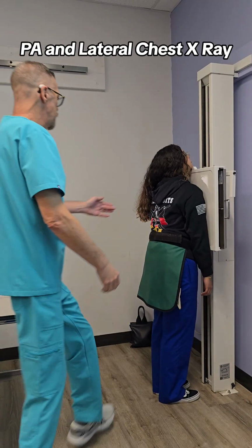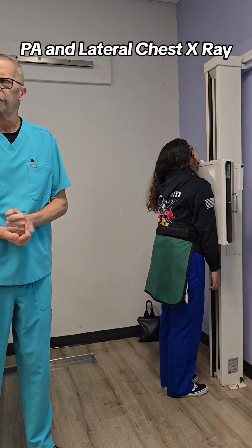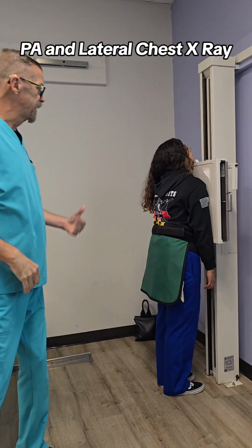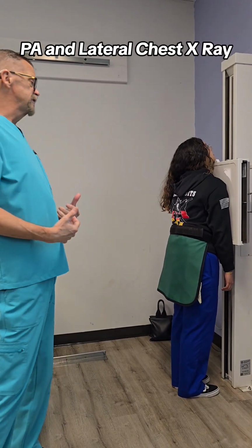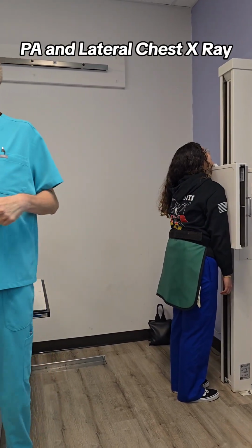Okay, have the patient stand perfectly still, shoulders rotated inward. What are our breathing instructions here? Expose on the second inspiration. So we're going to have our patient take a deep breath in, let all the air out, take another big deep breath in and hold, and we take the exposure. You can breathe. You can relax.